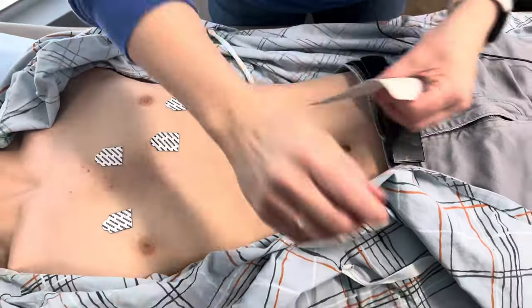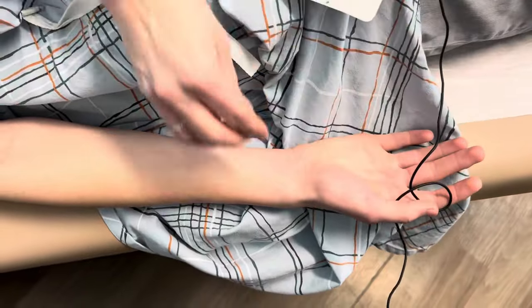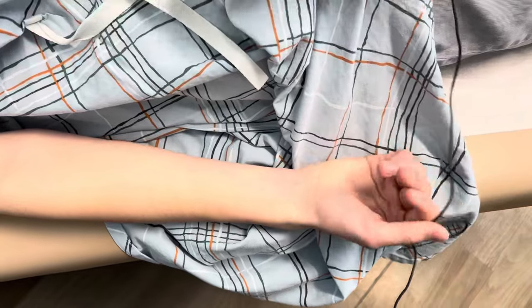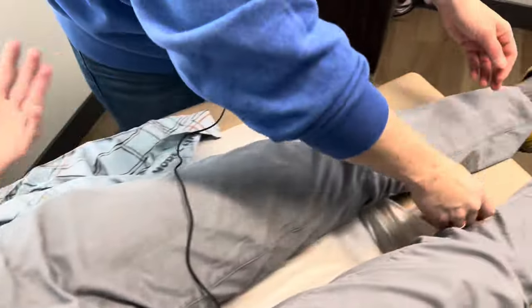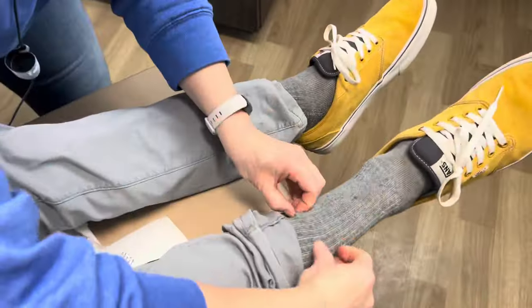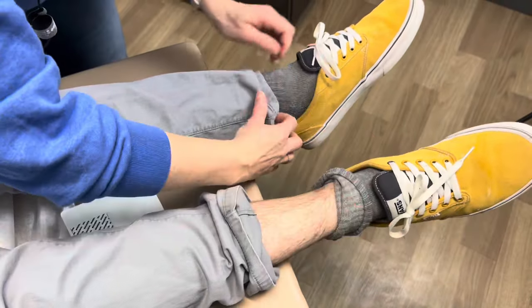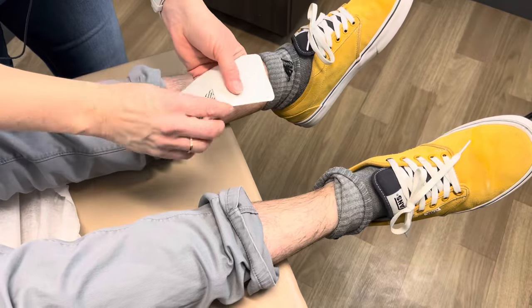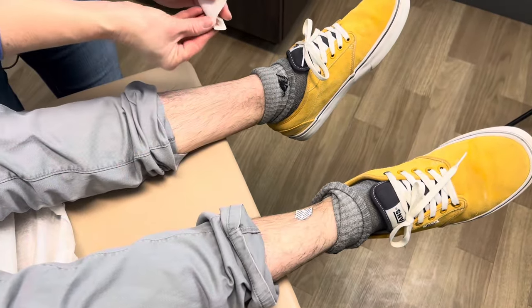Then you have four limb leads. Whenever you're doing an EKG, you want to avoid bony prominences — like the bony part of the wrist — and really fatty areas. Put one on each wrist and one on each ankle. Again, avoid the bony prominences, like the medial malleolus.